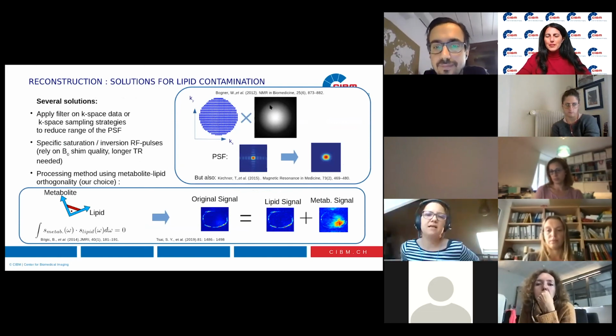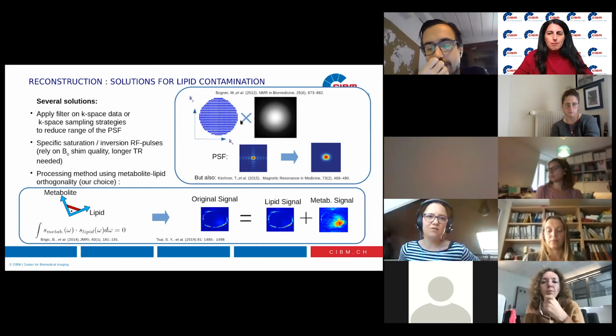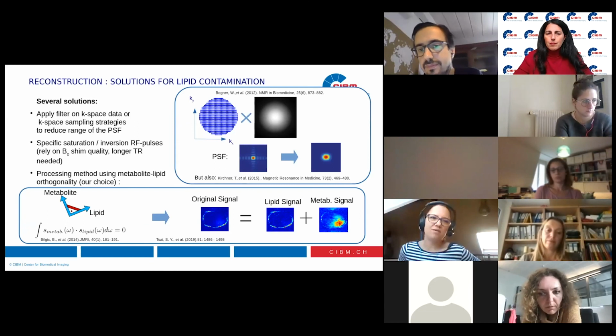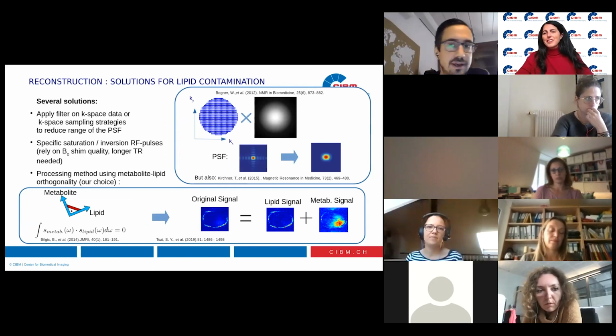But if you eliminate them, you can assume that you don't have errors because they were not half there or half not there, not taken into account. You just say that they're eliminated. It's like Maudsley when he's acquiring a metabolite spectrum without the macromolecules. In this case, we're quite sure that we can see the baseline is really flat.